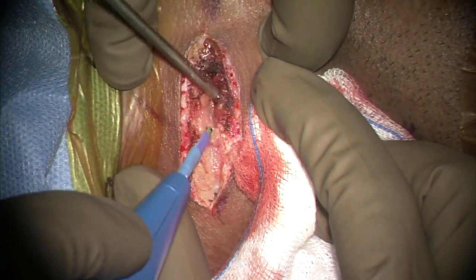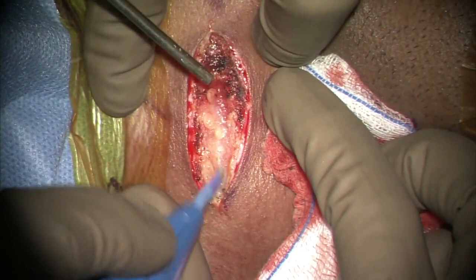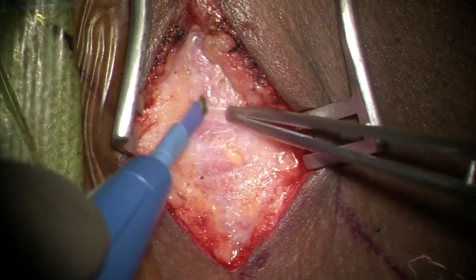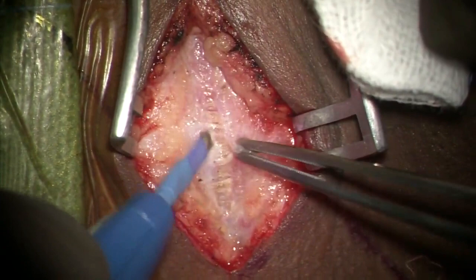A skin incision at the appropriate level is taken following subcutaneous infiltration of adrenaline solution. After skin and subcutaneous dissection, the longitudinal muscle fibers of platysma are identified and divided along the line of incision.